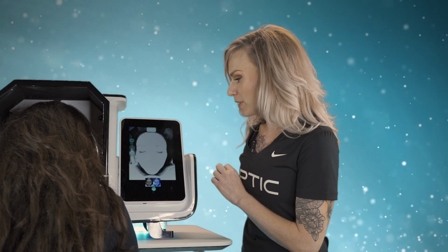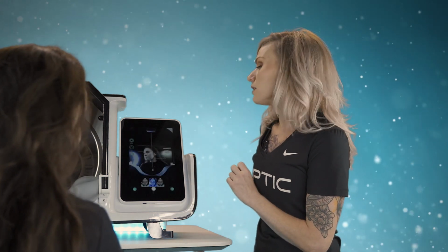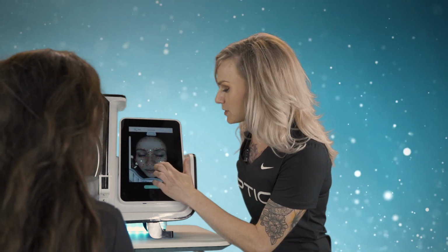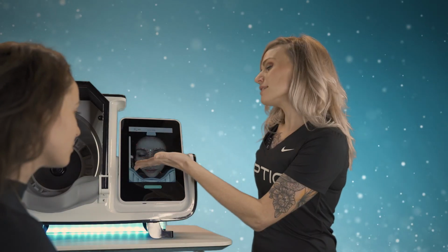You'll see 3 flashes of light, RGB, UV. One more second, just bear with me. And then the polarized, you can come on out. We're gonna go right over here into adjusting your parameters. So let me go ahead and adjust these parameters. So your analysis is in progress here. It's gonna take those 3 pictures and break it down into the 10 images that we can go ahead and look and see what your skin's up to.